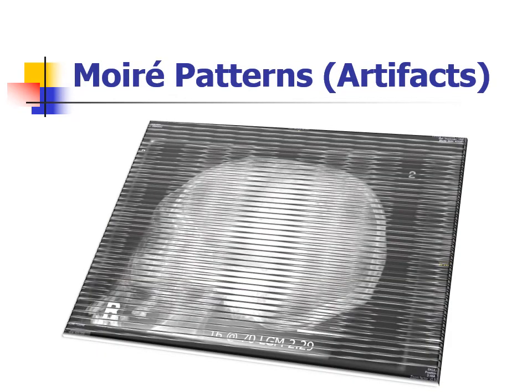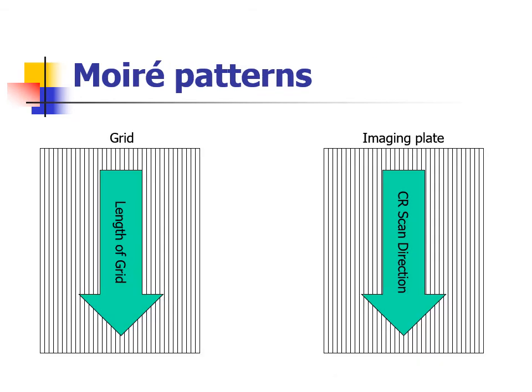Do some of your stationary grid images appear with superimposed jagged and/or dark bars on the image, like the image below? This artifact is called a moire pattern and is related to the frequency of the grid along with the grid's orientation. Moire patterns occur when two parallel line patterns overlap and one or both of the patterns are slightly tilted relative to one another.